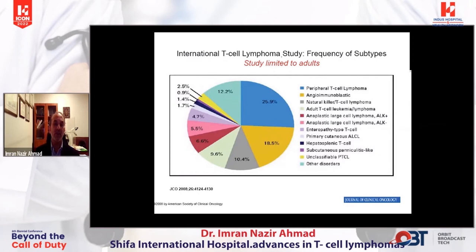Now I would like to share some of the cases of T cell lymphomas. I believe T cell lymphomas are hard to diagnose. They're pretty challenging because, as we discussed initially, most of the lymphomas lack characteristic morphological patterns. Most of the lymphomas lack characteristic molecular abnormalities, with few exceptions. So I would like to go over those cases which at least do present some characteristic morphological appearances, and they are associated with some sort of typical immunophenotype or a characteristic molecular abnormality.